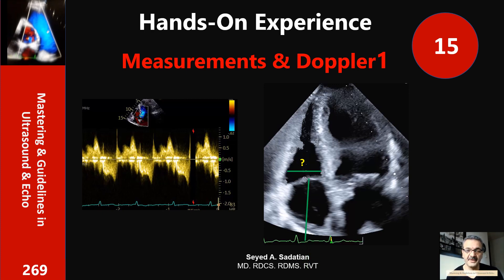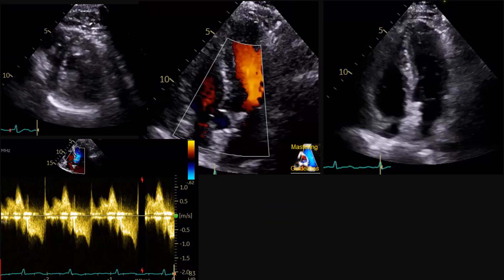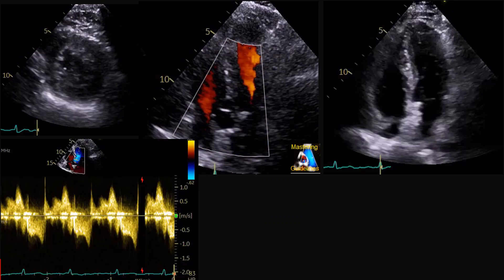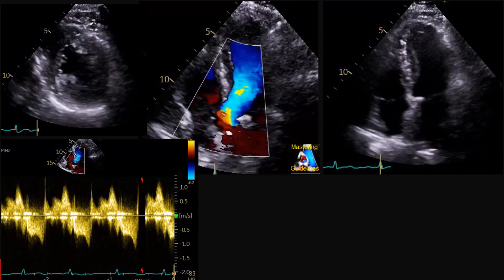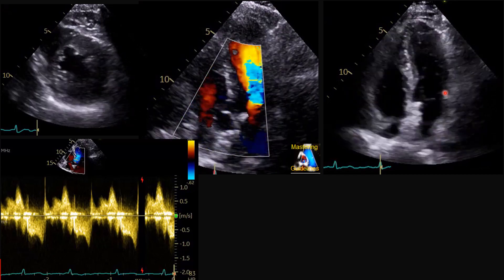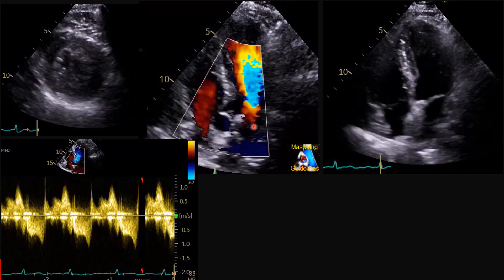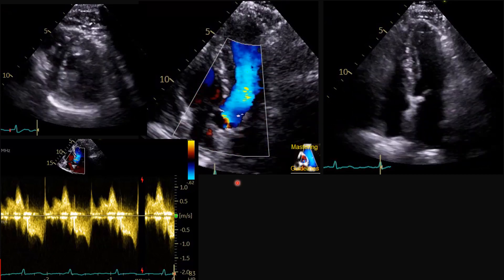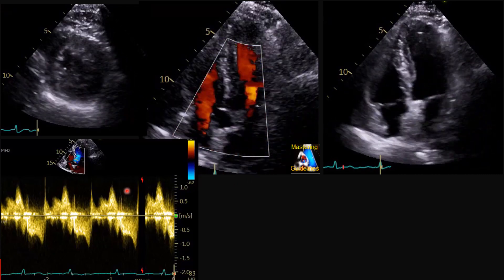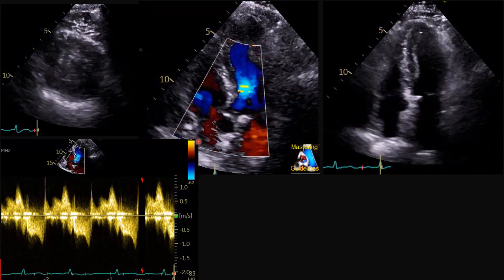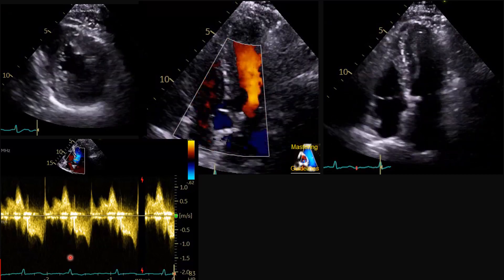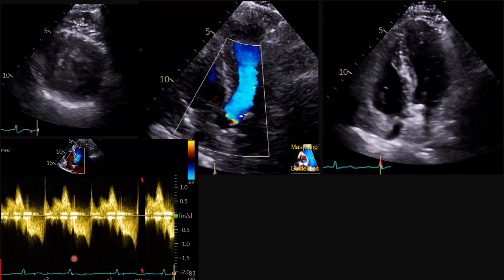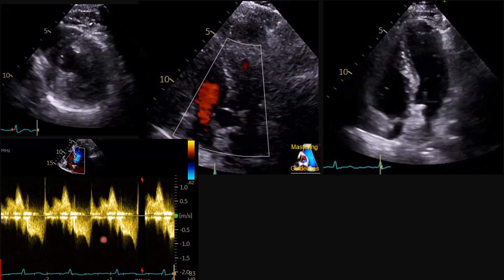Welcome to mastering guidelines in ultrasound and echo. Here we have a case, as you can see on the PSAX apical 4 and color Doppler. Based on those three views, the echo tech continues for the aorta and gets this spectral Doppler — which is the aortic valve Doppler.